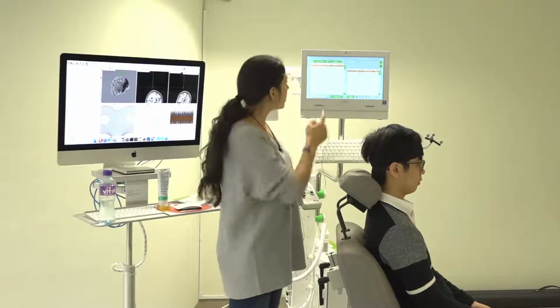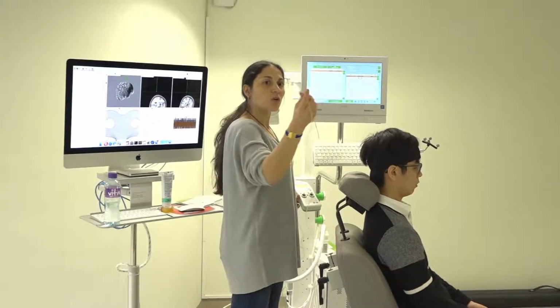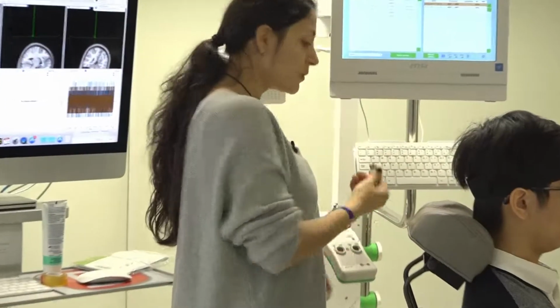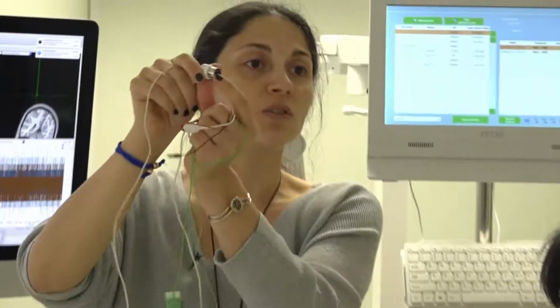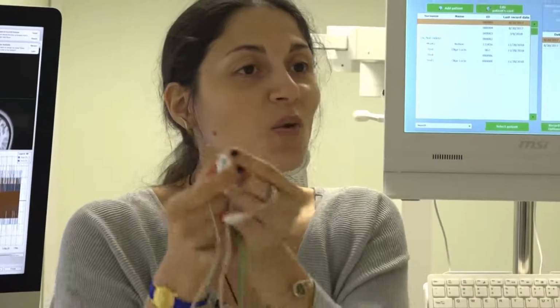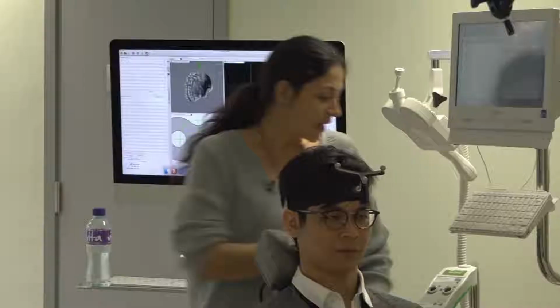If you are working with channel 1, make sure it registers channel 1, so connect the cables to channel 1. It has a way to go in, so pay attention. Don't try to force it because you will kill it, and it happens. So check where you have to insert so you don't damage the equipment, and it goes in easily.